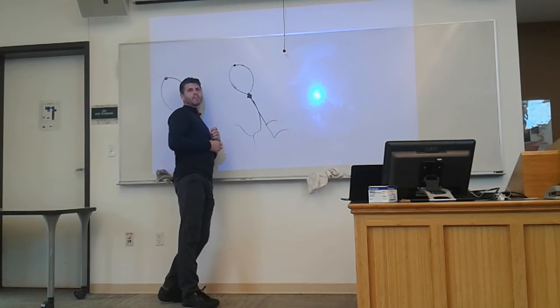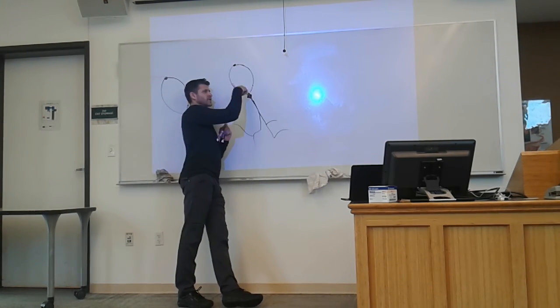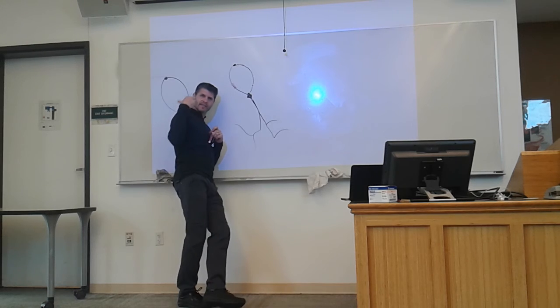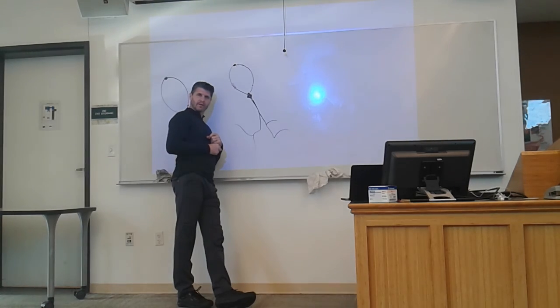Give me more information. What would happen in that circumstance? And then you just get continuing P waves on the EKG. What would happen electrically in that circumstance? Take it a step further, or give a bigger description of what ultimately is going to happen. Just multiple contractions over and over.